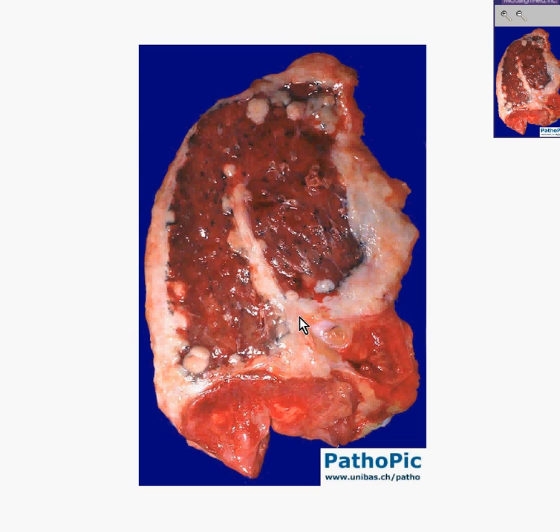So, microscopically, however, nests of mesothelial cells, if they are malignant, can look a lot like either squamous cells or adenocells. And a lot of times you have to do special immunostaining to differentiate the two. So let's look at the microscopic appearance. Remember, these tumors may tremendously compress the lung or even invade the lung, like you see here. But most purists would not want to call them primary lung tumors.